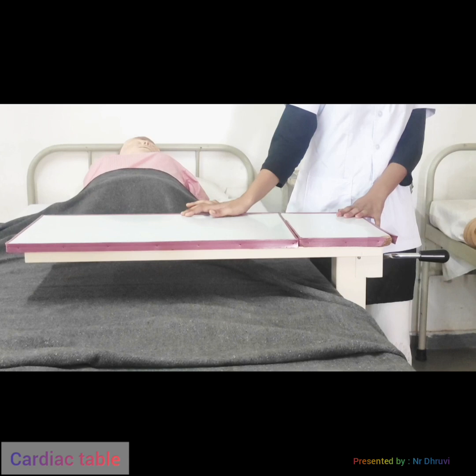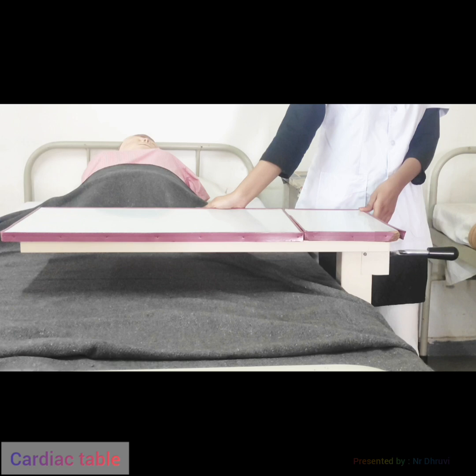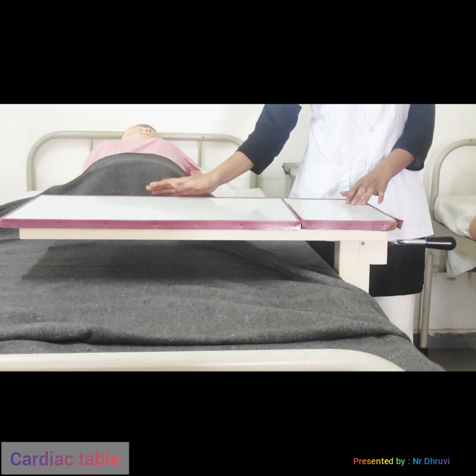It is placed in front of the patient while in an upright position. It is also called a cardiac table because it is normally used by cardiac patients who can lean forward with a pillow. It is used for patients who lean forward, especially when sitting for a long time, and for patients undergoing diagnostic procedures like thoracentesis. You can adjust the cardiac table height according to the patient's comfort level.